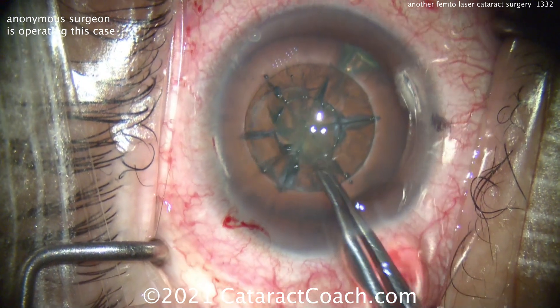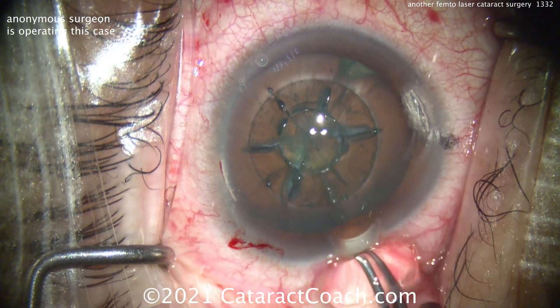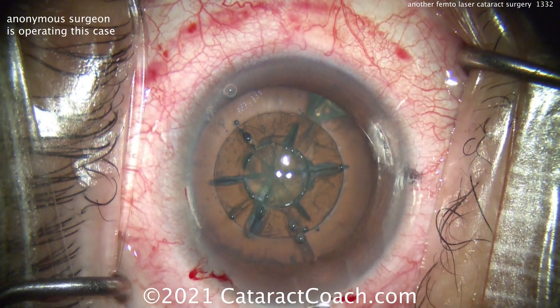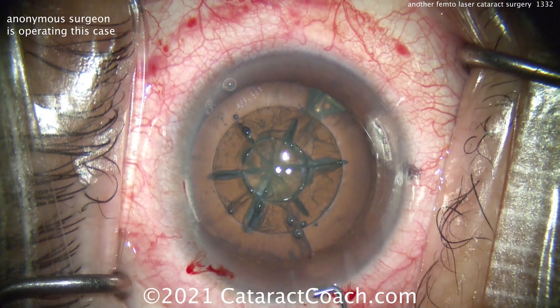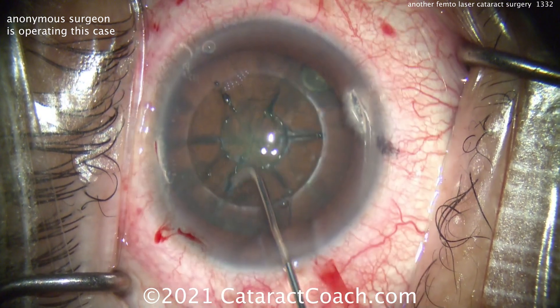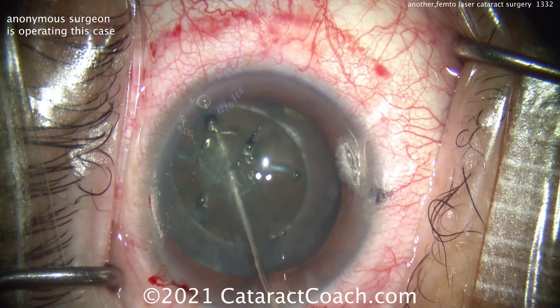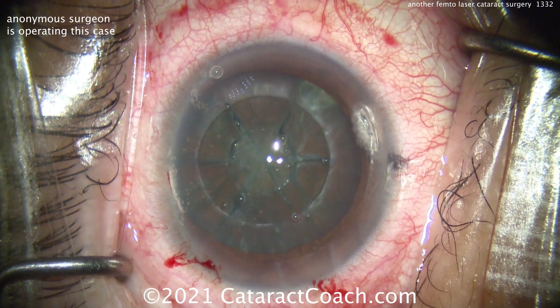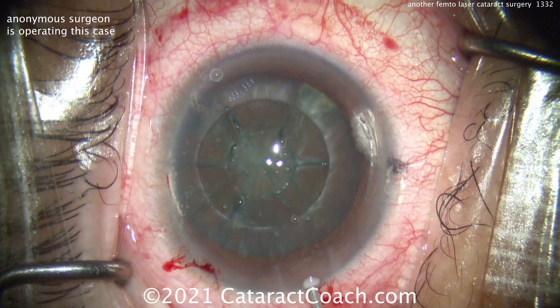Here's the capsulotomy being just freed up to make sure it's opened up perfectly and taken out of the eye, pushing out a little viscoelastic, and now some hydrodissection being performed. I agree — a steel blade or even a diamond keratome, if you want the best, makes much better incisions than the femtosecond laser for the most part. And you can see this surgeon also believes in our theory of nicking those limbal vessels here.